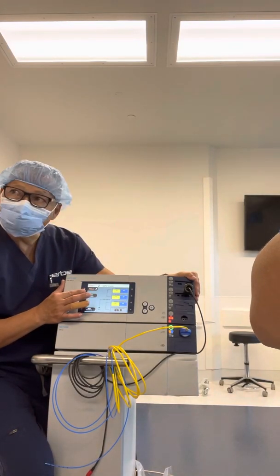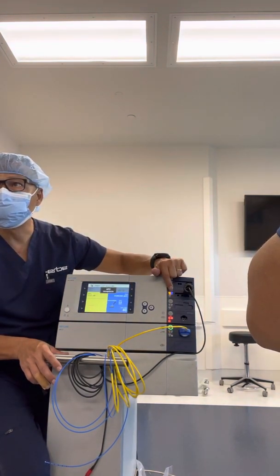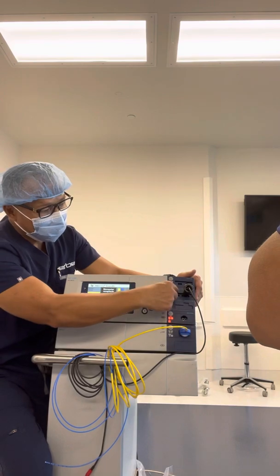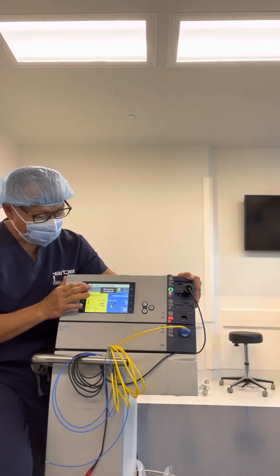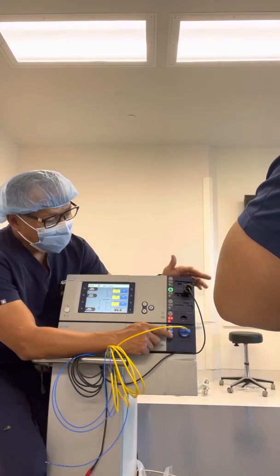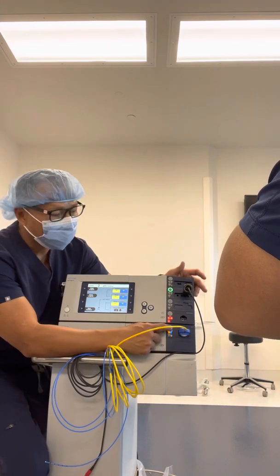He found another polyp, so select endo cut snare — step one, see how it jumps up here. Step two: engage it by touching the doorbell button, and you're set. Make sure everything shows green light here and the foot pedal here. Typical mistake: guide program, select program, APC — if you don't check up here and just follow the foot pedal color, people make a mistake. They see the green light up here and think it's active there, but you just told it APC so it engages down here.